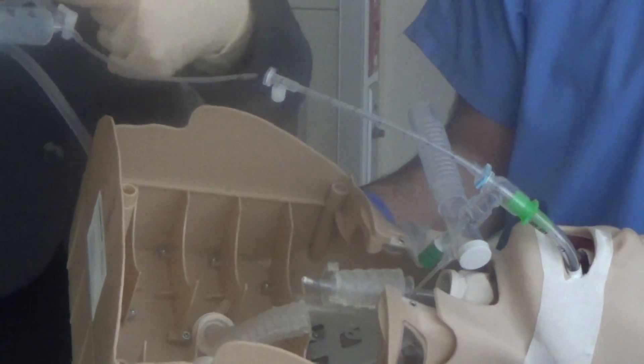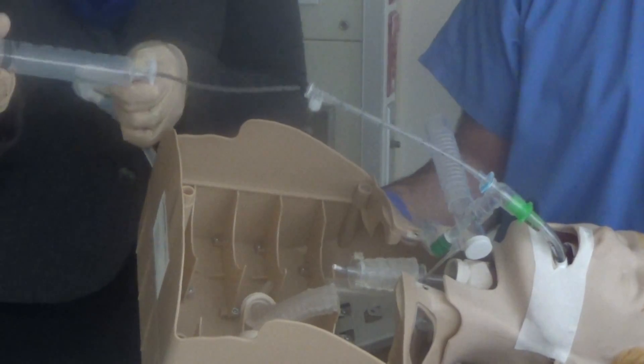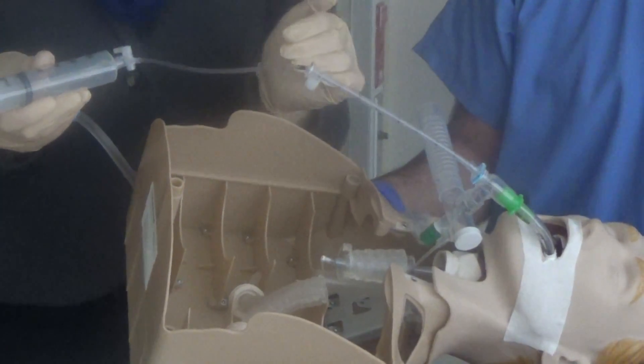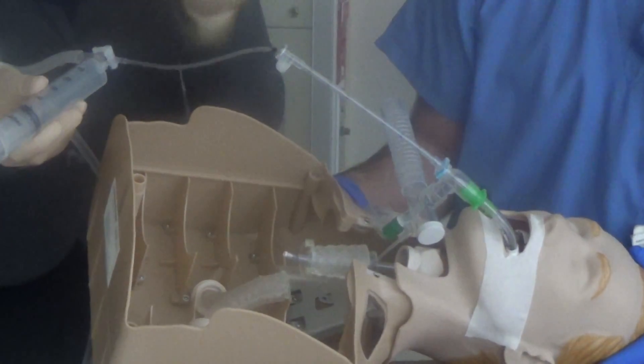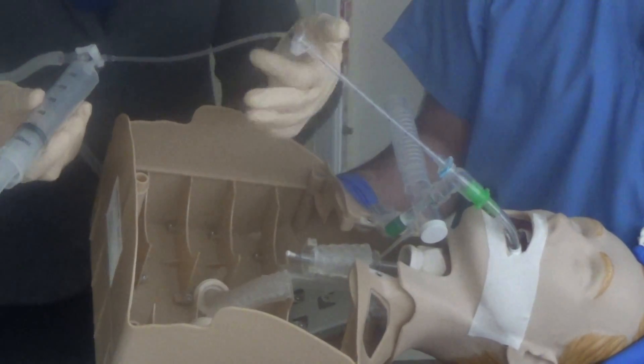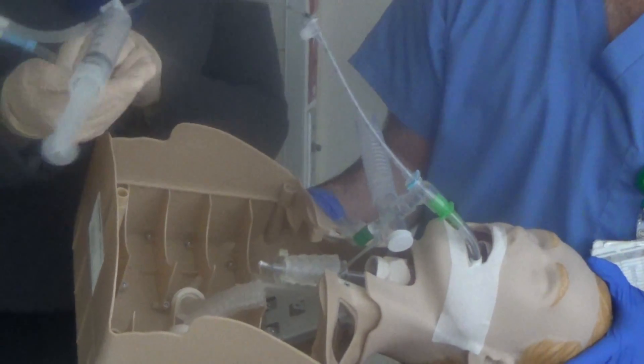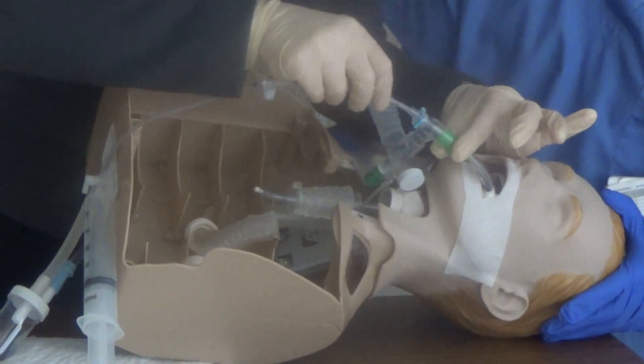With the three-way stopcock, suction is off, meaning saline is on, and I'll give a quick flush. Now I want to choose the direction — right or left, depending on physician orders — and advance the catheter four to six centimeters past the end of the ET tube. The outer catheter has been advanced, so the inner catheter has not been advanced yet. At four to six centimeters past the ET tube, we are past the carina and out into the distal airway.